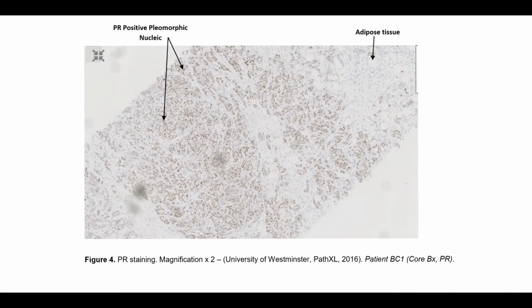This is an immunohistochemistry of progesterone receptors of the patient. A similar status can be seen in the core biopsy of PR staining. Here we can also see cells that have a high degree of PR receptors expressed in the nuclei. This is directly linked to genes involved in overexpression of the PR receptors. PR and ER receptors are normally associated with invasive ductal carcinoma of the breast.